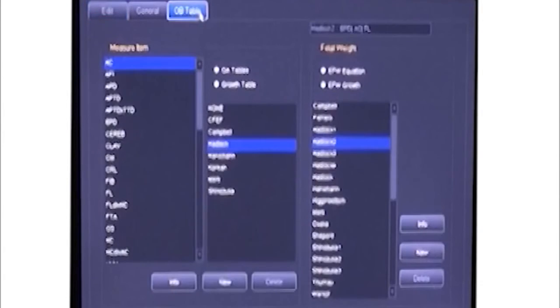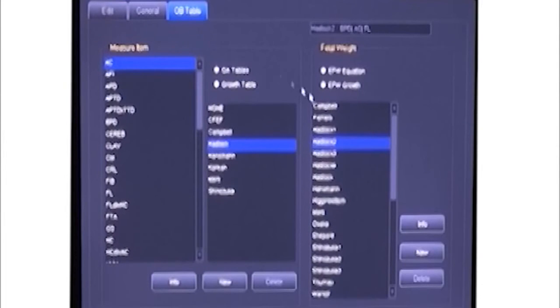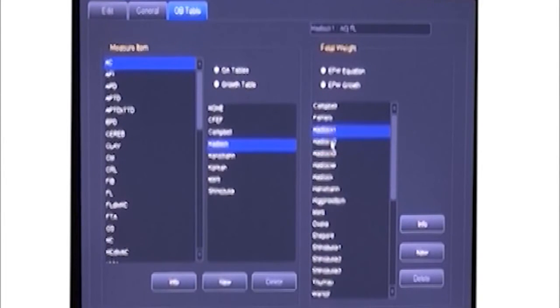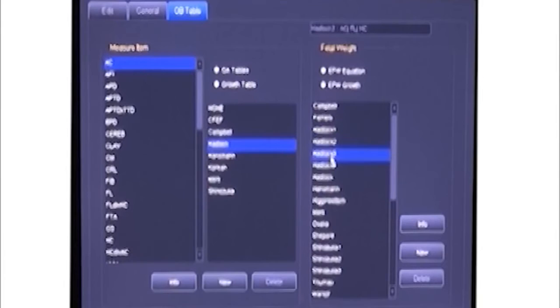We have an OB table here. Doctor can choose the OB method which he likes.